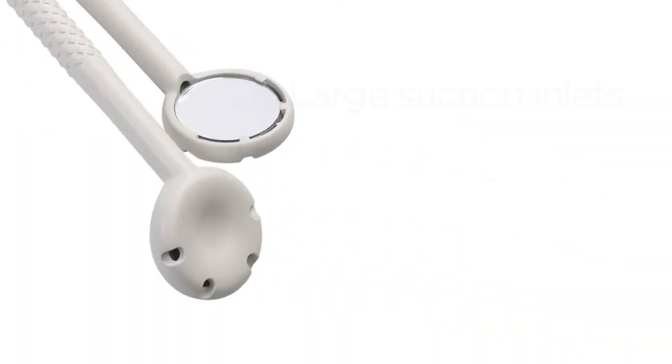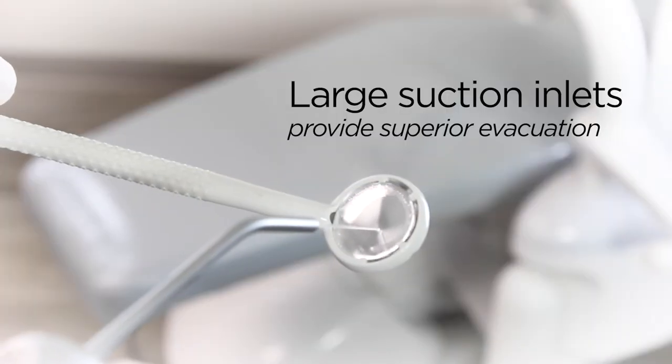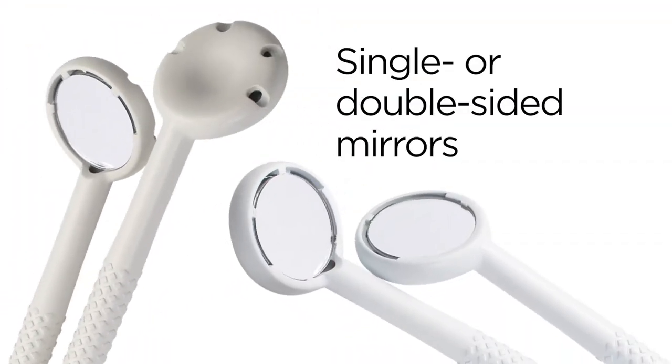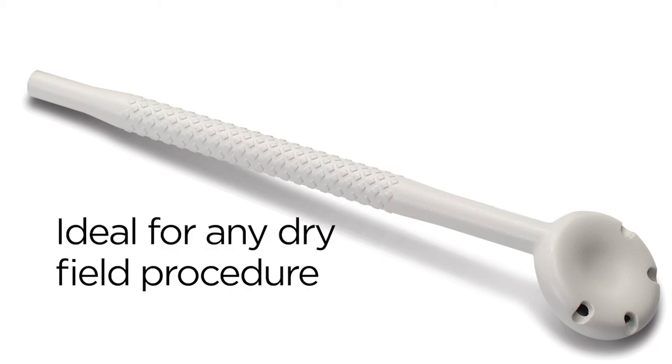The lightweight Miravac 2 features large front and back suction inlets that provide superior evacuation with minimal tissue grab. Available with single or double-sided acrylic mirrors, the Miravac 2 will remain clear and fog-free even under direct exhalation. These great features along with a non-slip handle make Miravac 2 the ideal tool for any dry-field procedure.